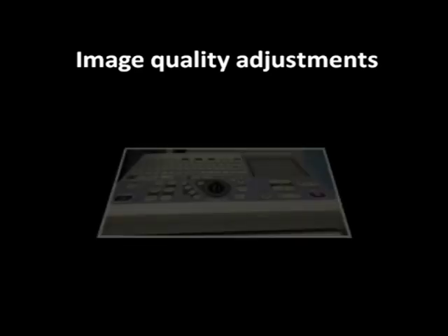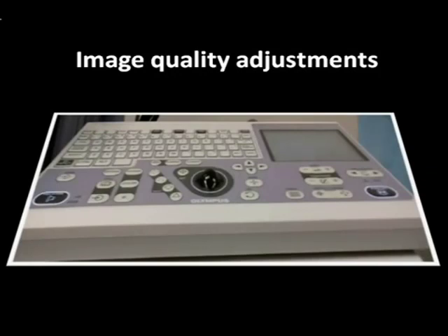Now that we have reviewed basic ultrasound physics, terminology, and image distortions, how can we improve the quality of the ultrasound image while performing EBUS TBNA? This can be done by using the gain, depth, and Doppler functions on the image processor. Knowing how to improve image quality in order to better distinguish lymph nodes from vascular structures can enhance diagnostic yield and potentially improve the safety of EBUS TBNA.